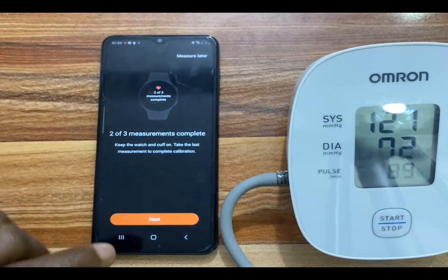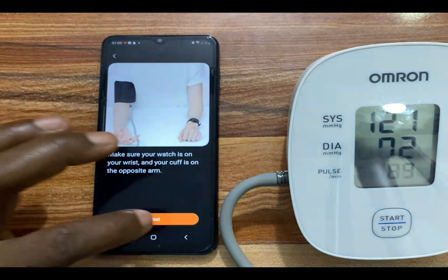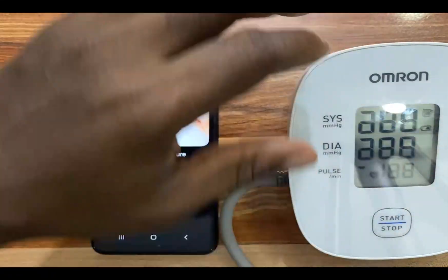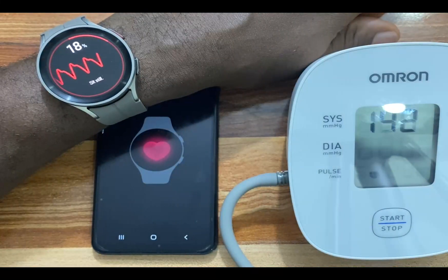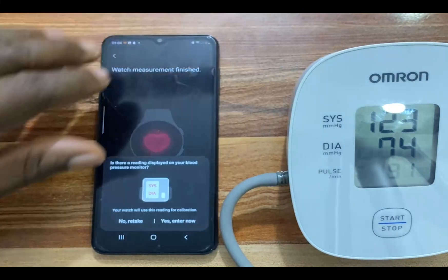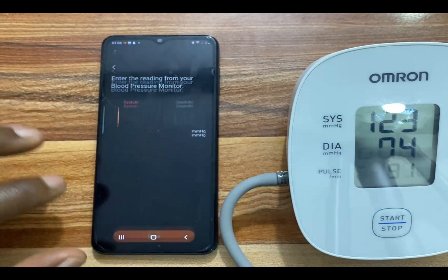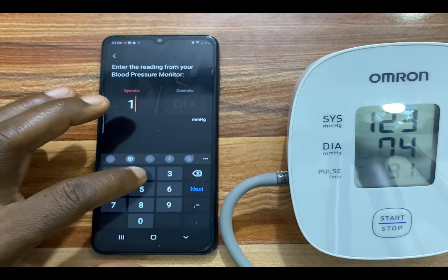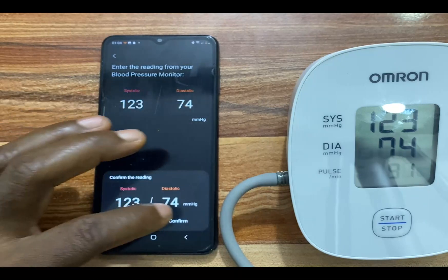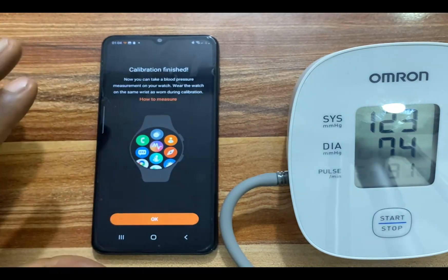We need to go ahead and finish this with the last measurement. Tap on Next, and tap on Next again. Start the blood pressure monitor. We have the final reading — I am going to enter that. Enter Now — the diastolic is 74. Tap on Done and confirm this. It says calibration finished, so I am going to tap on Okay to finish.